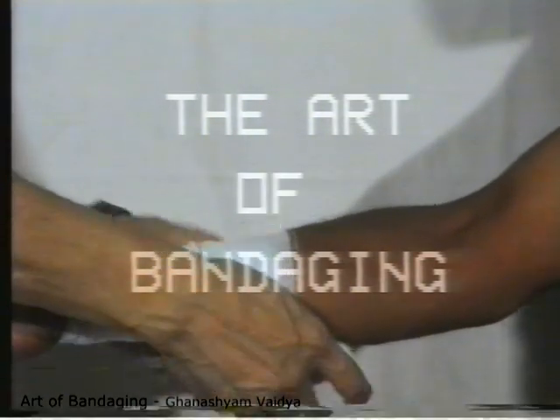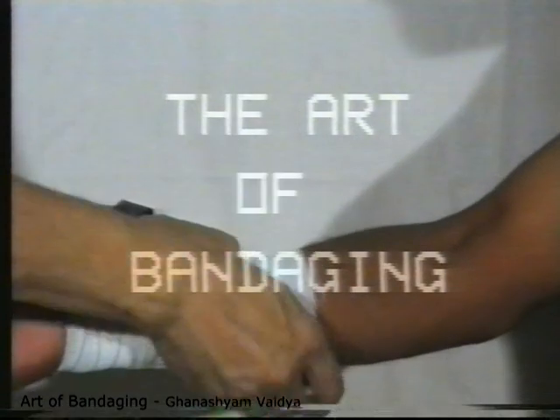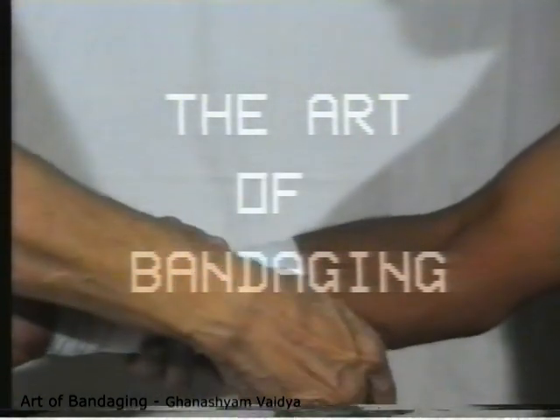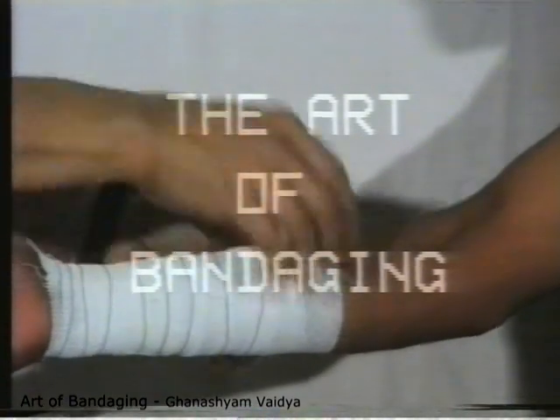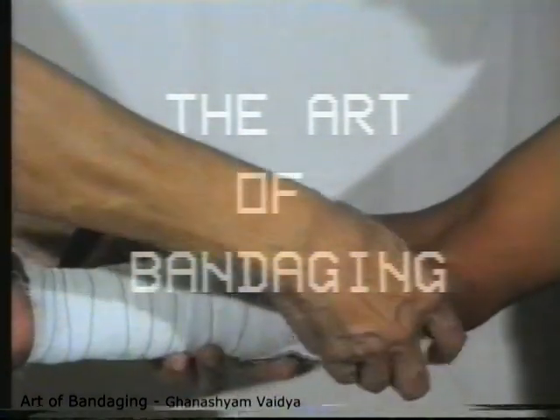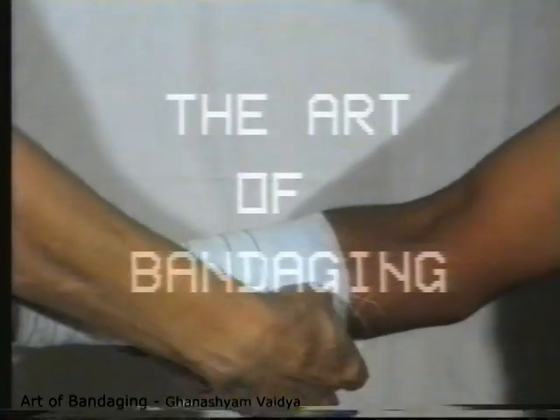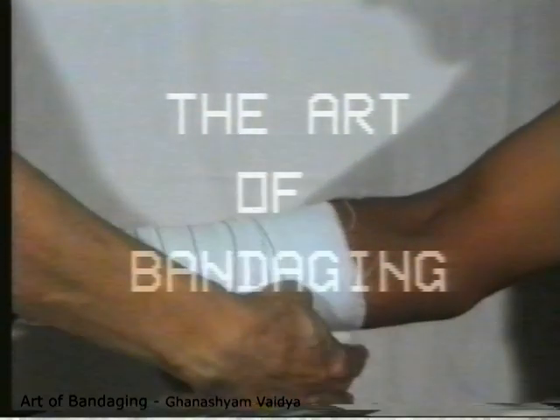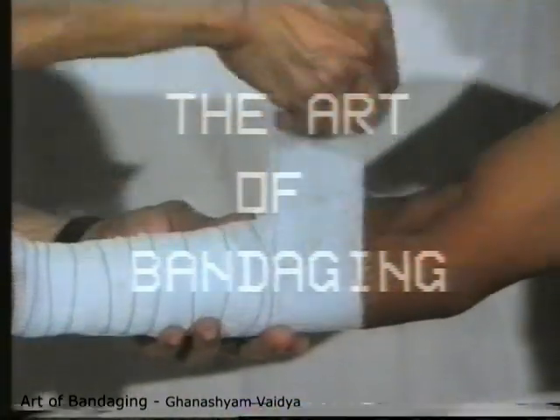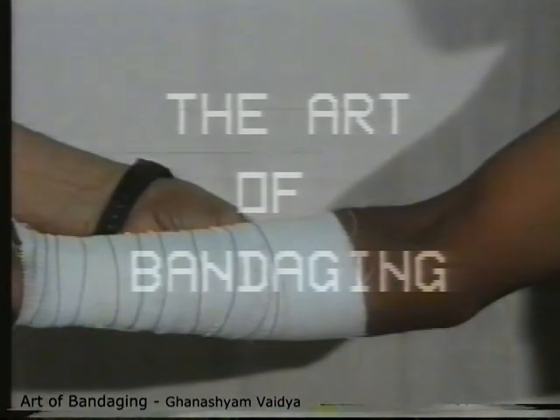In this class, we will be studying the techniques of application of the commonly used cotton roller bandages to various parts of the body. We will also look at various other types of bandages and their specific uses. The art of bandaging has been demonstrated by late Dr. M.K. Vaidya, a master surgeon who considered the art of dressing and bandaging as important as operative techniques.